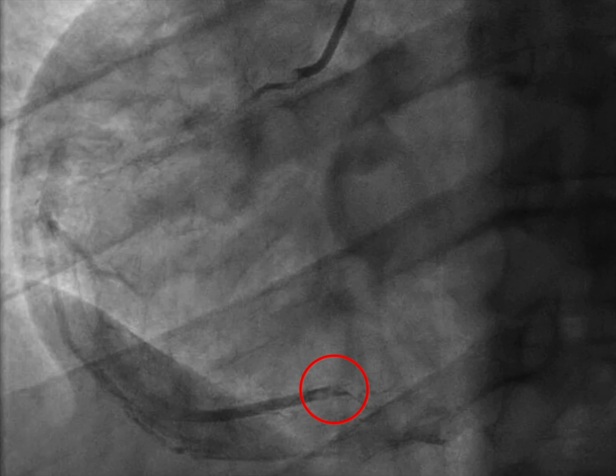And the other thing you see is that there's this little tiny branch vessel here at the proximal vessel, the proximal RCA rather, that has contrast hang up. This implies that there's thrombus in this vessel, and it's causing contrast to move through it really slowly. You can't really tell what this is. At first glance, I thought it was probably an RV marginal branch, but when I compared it to the old angiogram, I think it's more likely an atrial branch. But either way, you can tell that there's thrombus in the proximal vessel here.